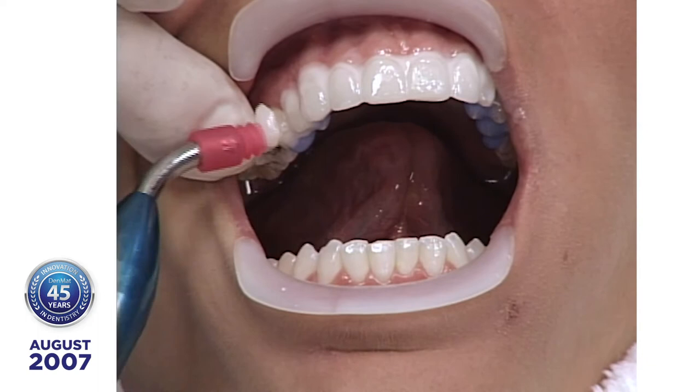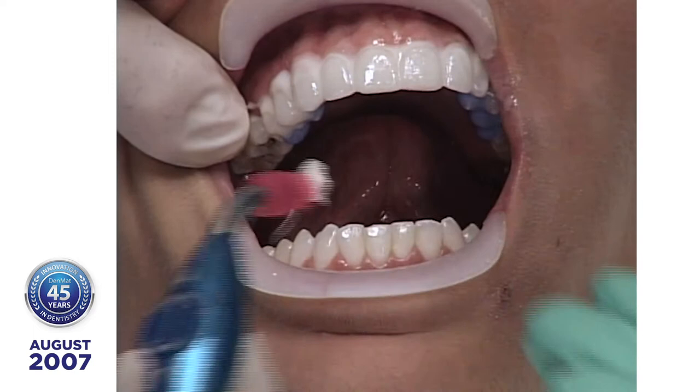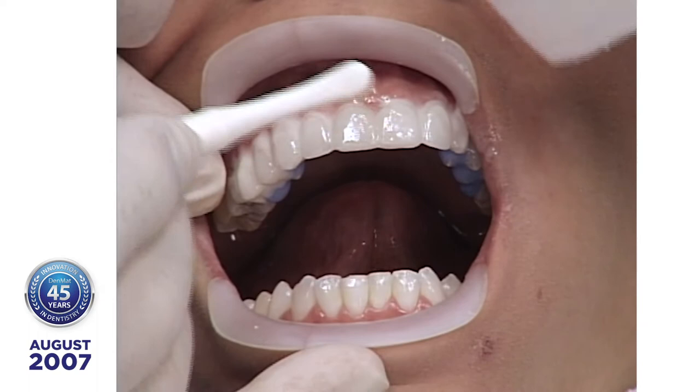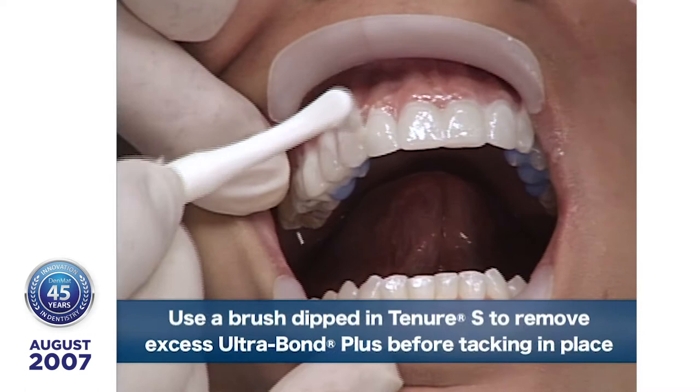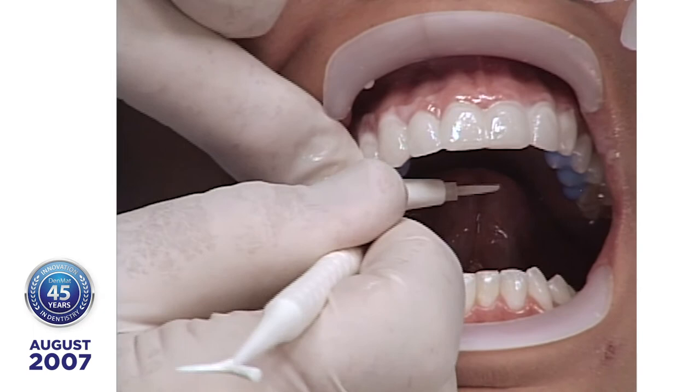Left first bicuspid. Right first bicuspid. I always call out the name of the tooth and repeat it — you heard me say left and Jessica corrected me that it was right. So when I misspeak, she's my co-pilot. Now we'll wipe off the excess. This is on the runway getting ready for takeoff — we just take out the excess. My objective is to get a well-bonded, fixed lumineer. I don't mind a little messy cleanup, because think about what I didn't do to prepare this patient.